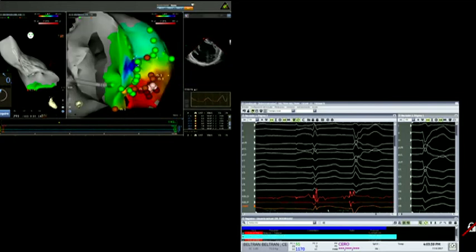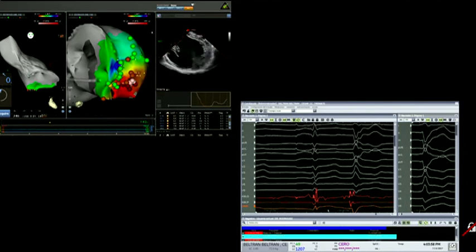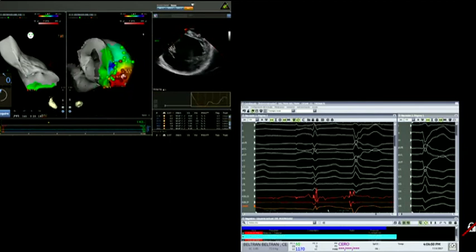Andrea, you hear me? Are you still there? We are discussing the doses for the dobutamine test. As far as I remember, it's around 40 mics per kilo. I have the doses here, but it looks like a very high dose. Yeah, I have the protocol with me.